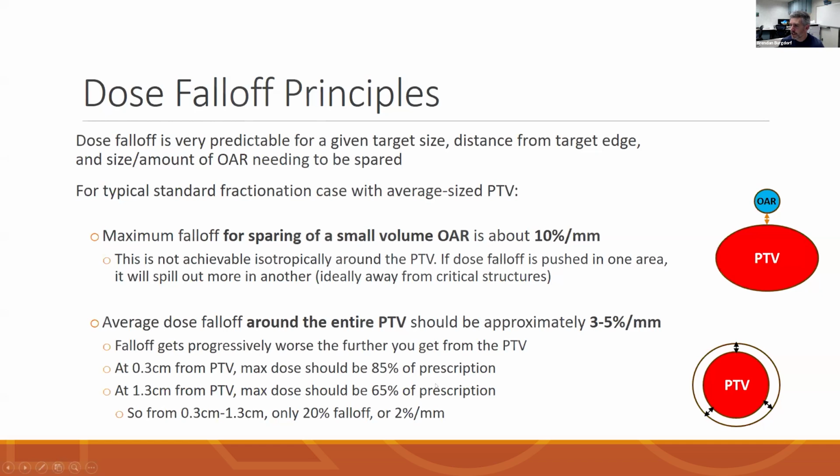But these principles are important to understand because it gives us an idea of what is achievable in terms of fully covering the target and sparing the organs at risk around that target.